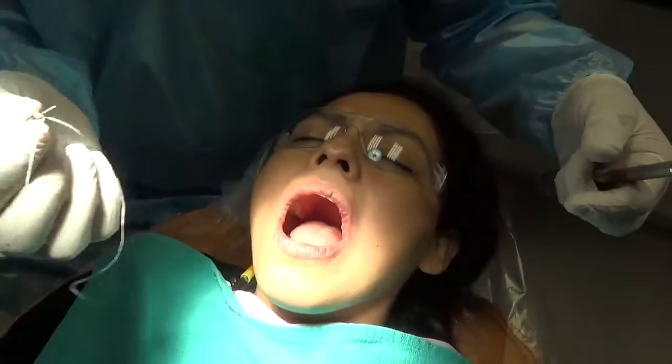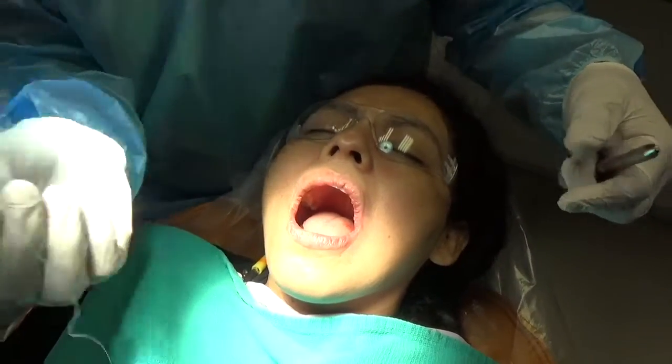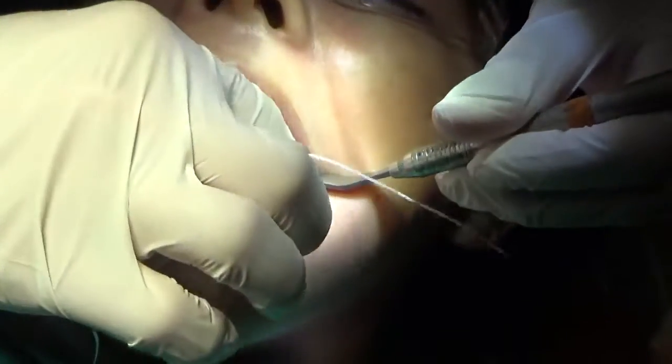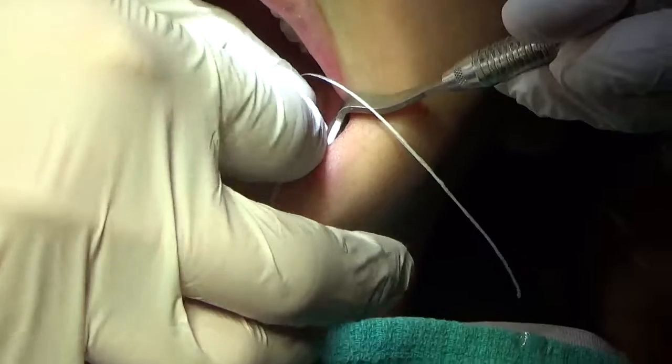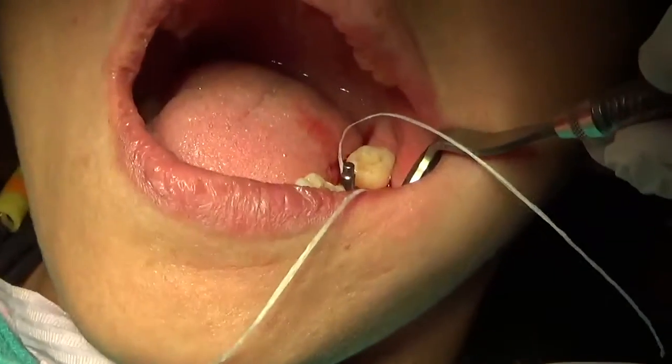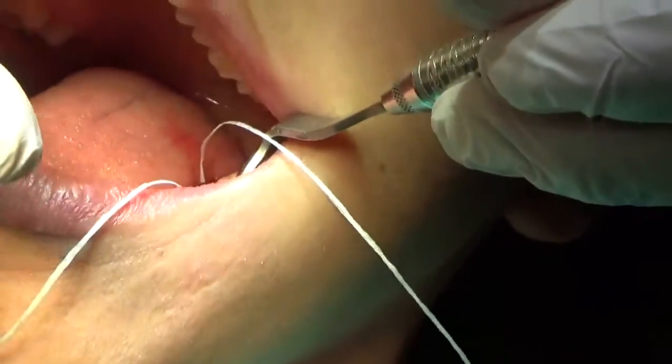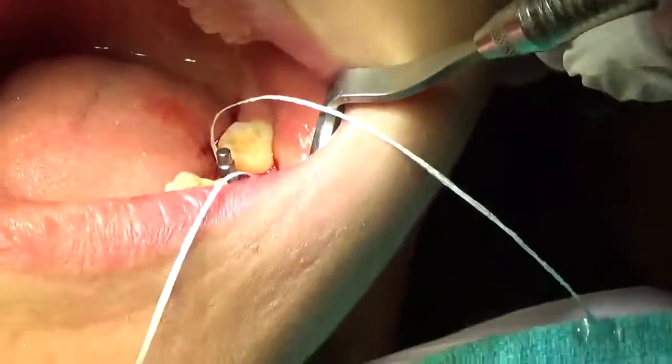There's a piece of floss hanging off of it, see? Because what this is, just a little pin that I'm going to take over here. I'm going to put it right into our pilot hole in the back of the mouth. And here I can do a couple things. One, I can look. I can just visualize and see where we are, see if we're along the central groove.